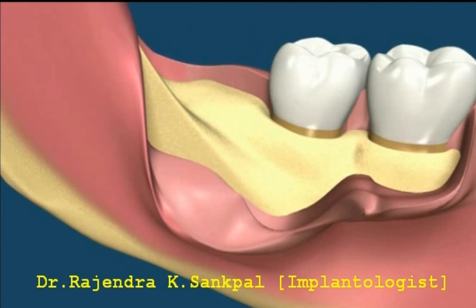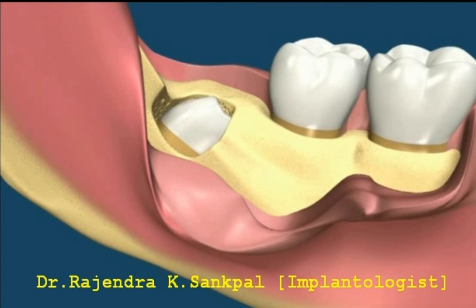The bone is removed to gain access to the tooth, and the tooth crown is sectioned. The tooth crown can then be removed.